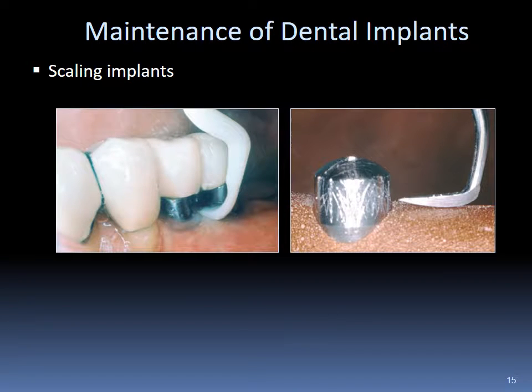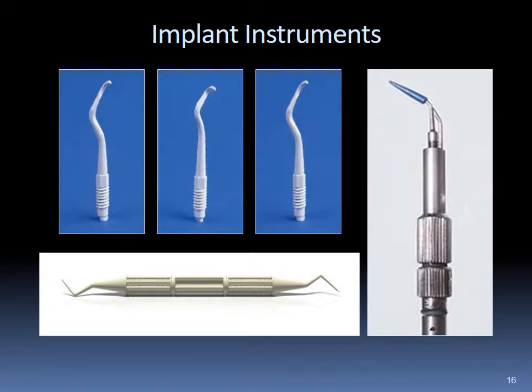Current research on the use of metal scalers and instruments is underway, and we may see a change in their use on dental implants in the near future. At this time we continue to follow the protocol and use plastic instruments for implant assessment and preventive measures. Take a moment to study the various implant instruments recommended for implant care.